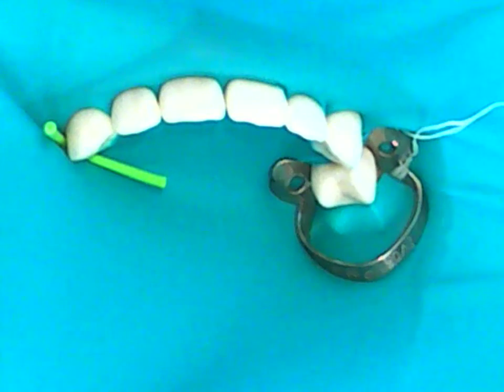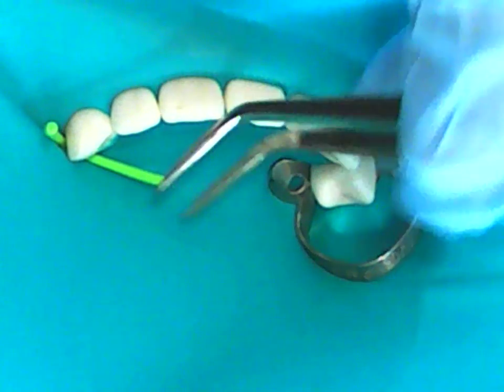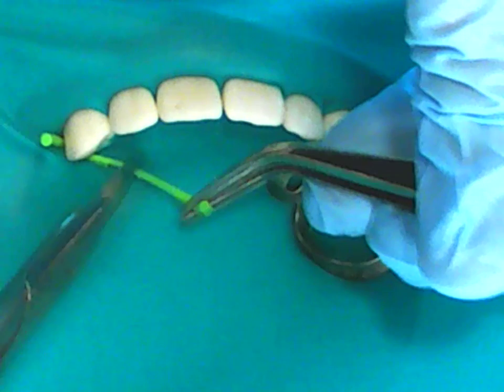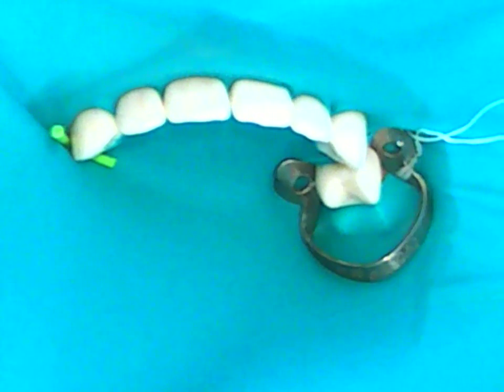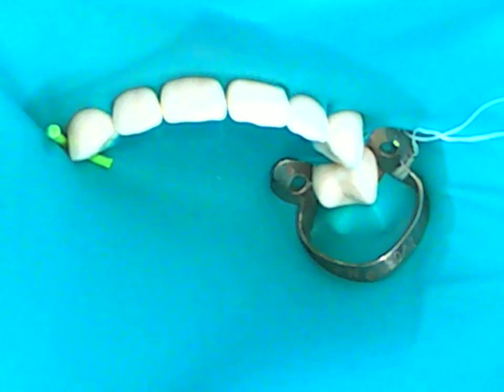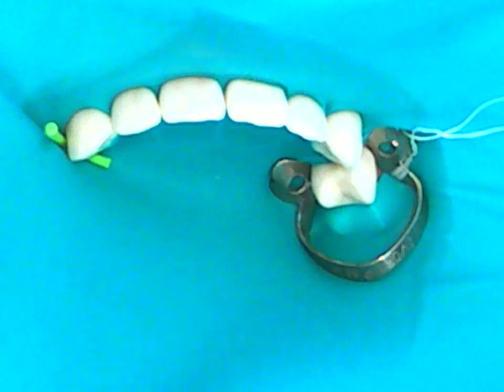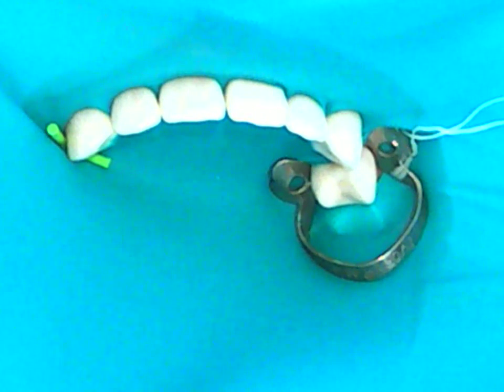So you could get a cotton pliers, hold on to the lingual aspect, and trim it. This can be quite tight to your tooth. This is not the tooth you're working on typically, so it's okay to have a little extra tag out the lingual. And then the facial might be okay as is. It's a little long if you want to trim it, but please leave some to hold on to for removal later. And that's the ligature I'm going to leave in.